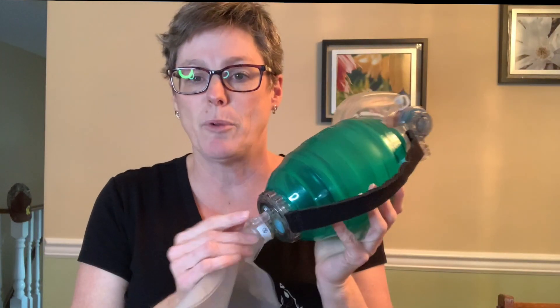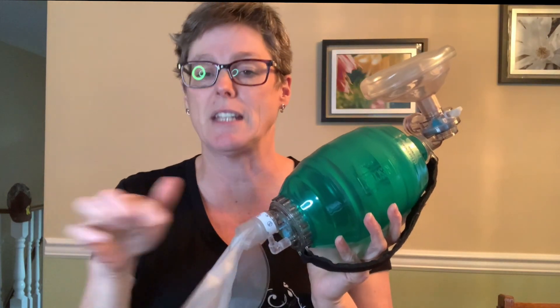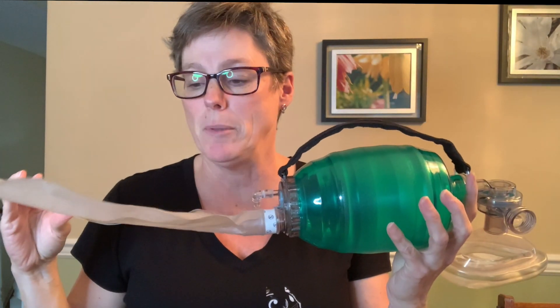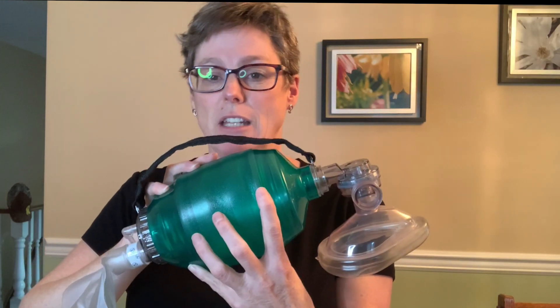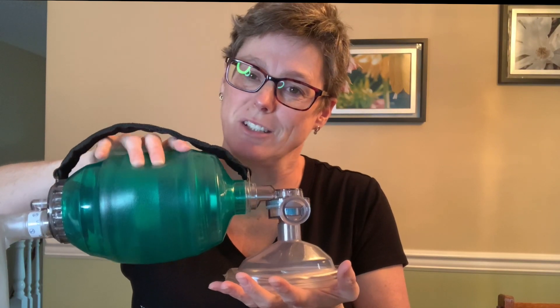This does come with a port for oxygen. It would be attached to oxygen, whether it's a canister or on the wall, and then this bag fills up and becomes a reservoir. The bag is full of oxygen, and when we put the mask on the patient's face it creates a closed system so that when we press on the bag the patient gets great oxygen delivery.